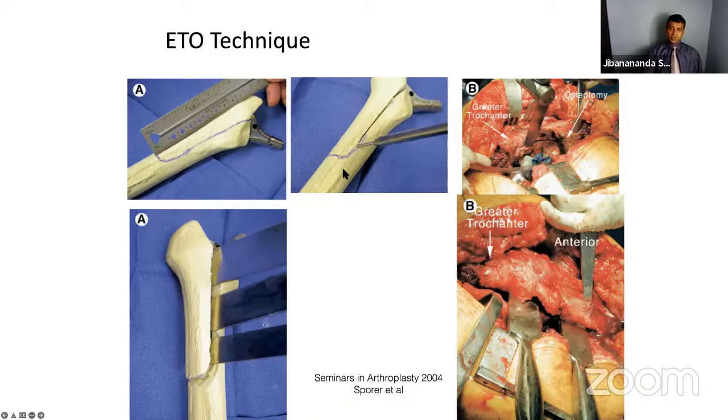femoral shaft fractures. Once you complete the osteotomy on the lateral side, I would also use a saw on the medial side. And sometimes people advocate to strip less soft tissue, and they would go through the vastus lateralis without lifting the vastus lateralis much and use a drill bit to make the lateral surface weaker, or the medial surface weaker, and then lift it up.